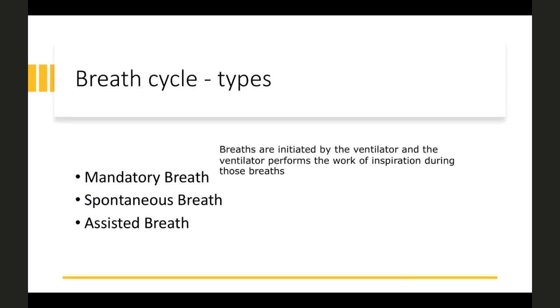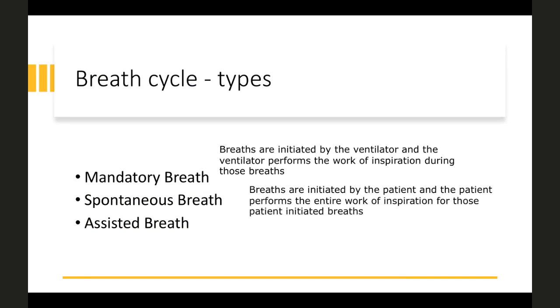Mandatory breath is breath initiated by the ventilator, and the ventilator performs the full work of inspiration during those breaths. So the ventilator starts, the ventilator maintains, and the ventilator decides when to change from inspiration to expiration. In spontaneous breath, as you and I breathe, all breaths are initiated by the patient, and the patient performs the entire work of inspiration for those patient-initiated breaths.